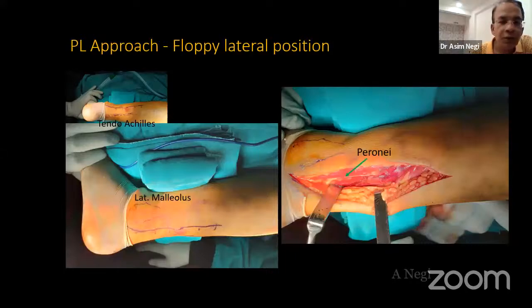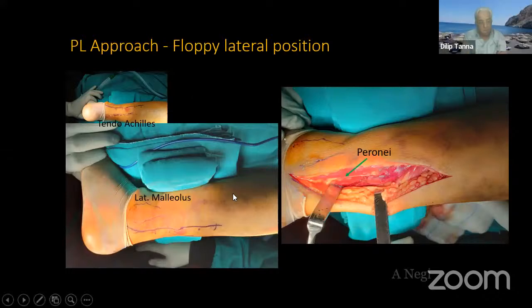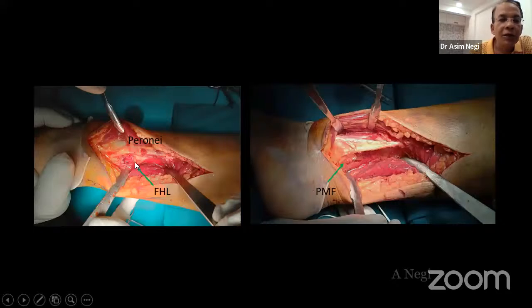So, plan was to use a posterolateral approach, lateral position. You can see the peroneals there. This is my FHL, which you can peel off with the finger. And you are seeing almost the whole of the posterior aspect of the tibia here. And that's your PITFL here.